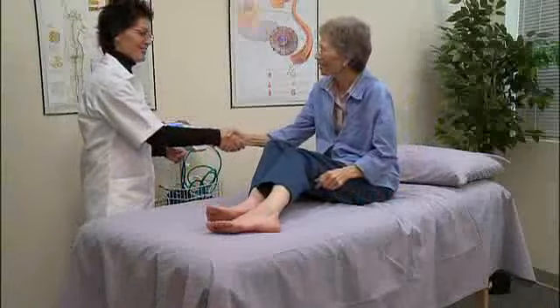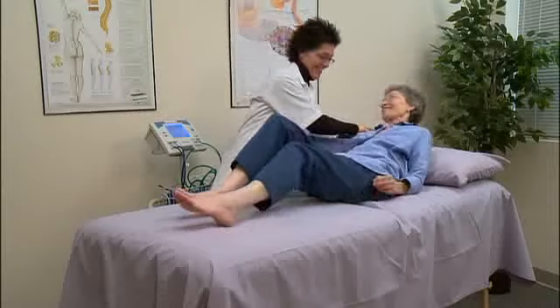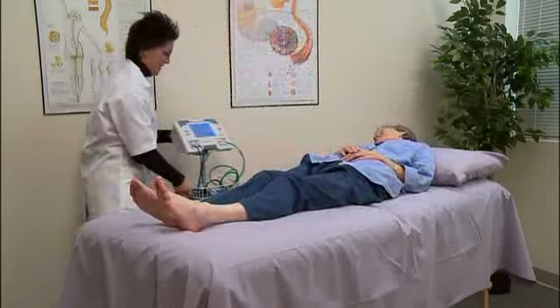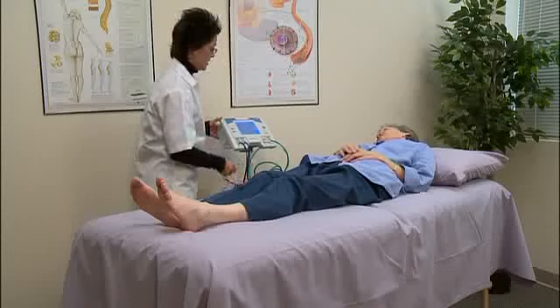Begin the exam by having the patient remove their shoes and socks. Allow the patient to rest in a supine position for about 5 minutes prior to taking pressure measurements. You may use this time to discuss the patient's current symptoms and to wrap the blood pressure cuffs.